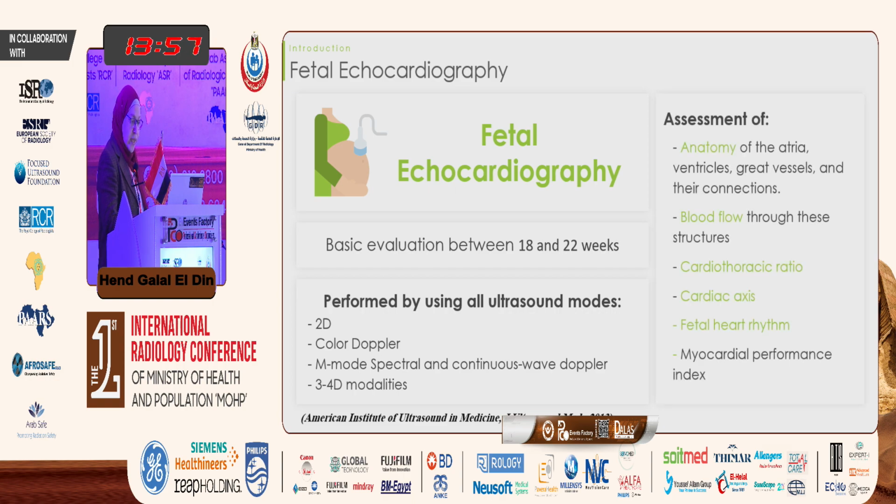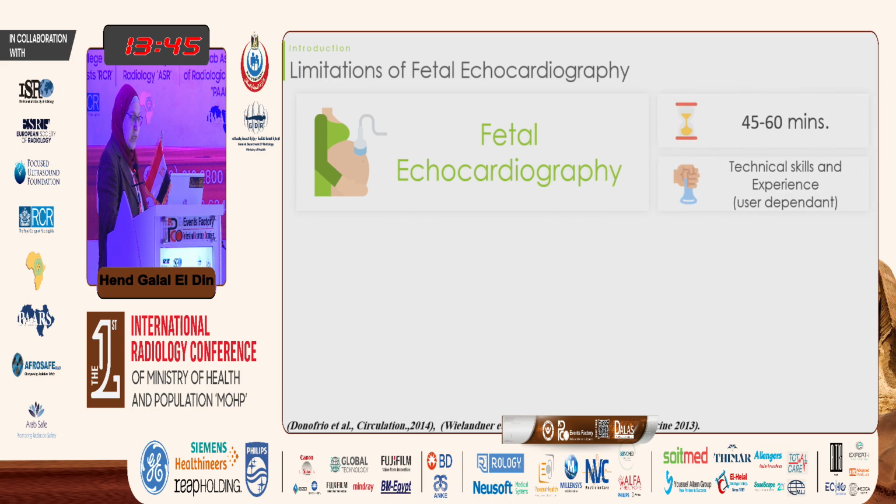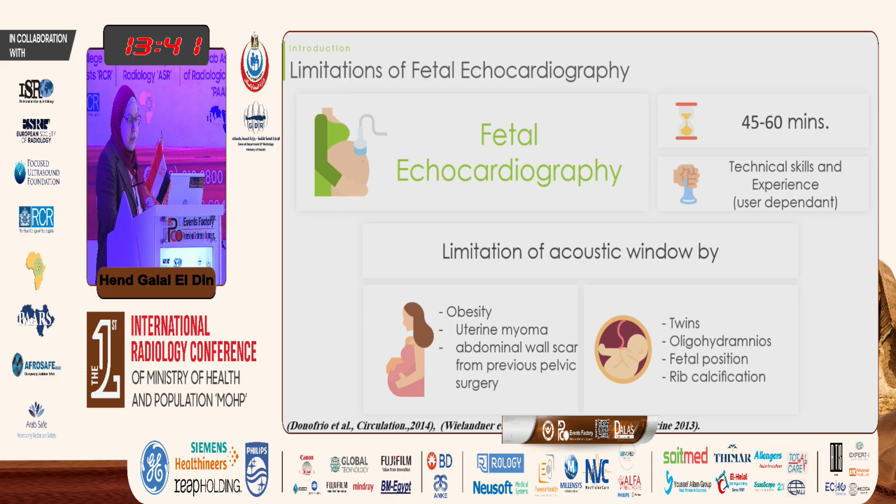This is to assess the anatomy of the atrium, ventricle, great vessels and their connections, blood flow, cardiothoracic ratio, cardiac axis, fetal heart rhythm, and myocardial performance index. However, there are some limitations of fetal echocardiography. It is time consuming, lasting up to 45 to 60 minutes. It depends on the user's technical skills and experience.